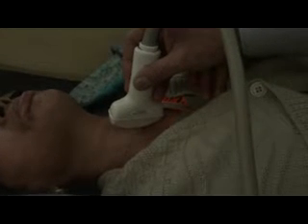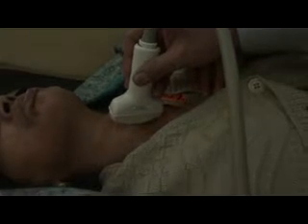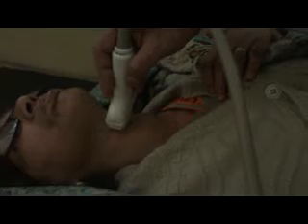Remember that the landmark for the thyroid gland is the common carotid artery. This is the common carotid artery in transverse section. With it, you will see a large vessel which is the internal jugular vein. Here we see the CCA — common carotid artery — and the internal jugular vein in transverse section. This is the thyroid gland, specifically the right thyroid gland, in transverse section.